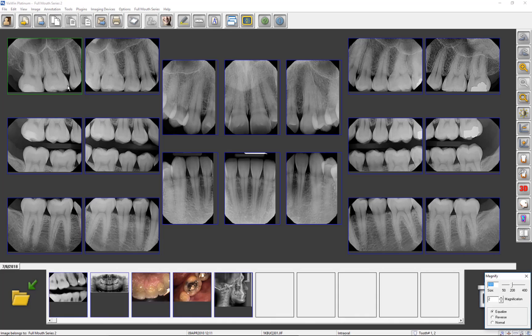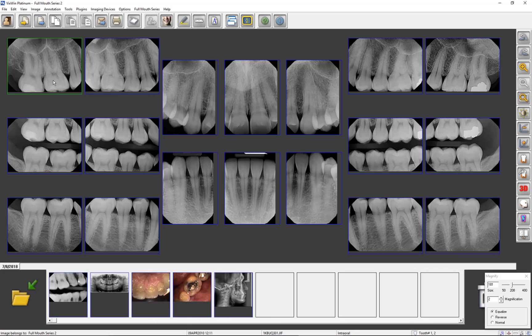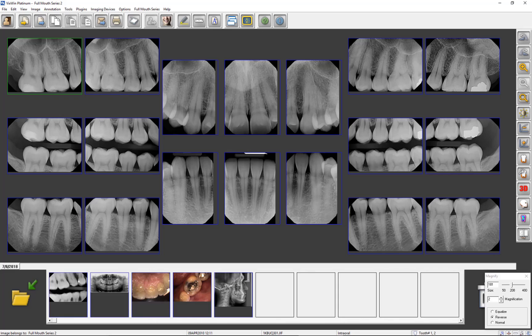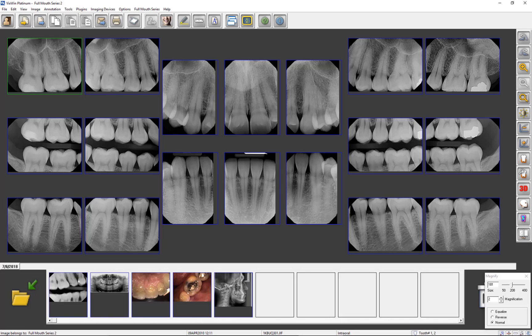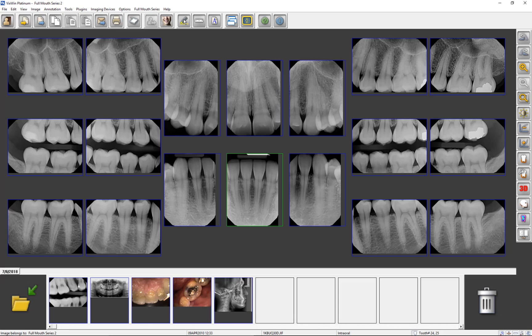Equalize will show or highlight morphological structures in the image. Reverse converts negative into positive. Normal magnifies the selected area without enhancing the view. Magnify may be added to the sidebar by using the aforementioned user interface. Image enhancement tools can also be found on the toolbar and in the Image and Tools tab of the menu bar.